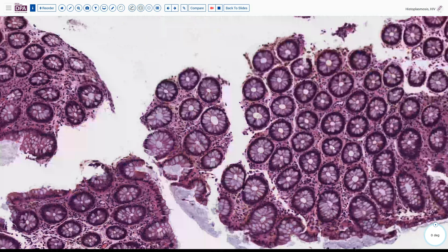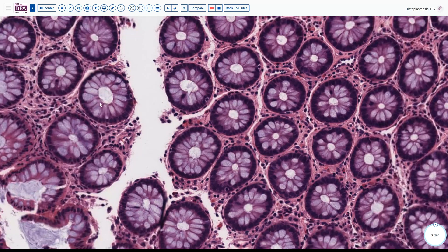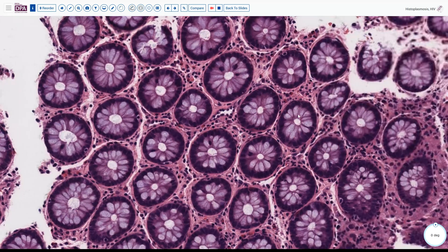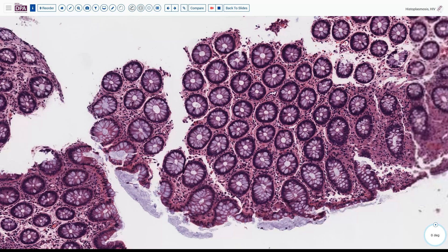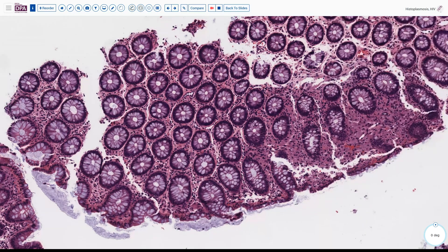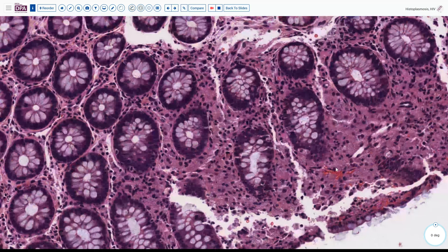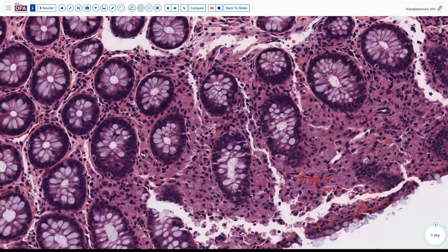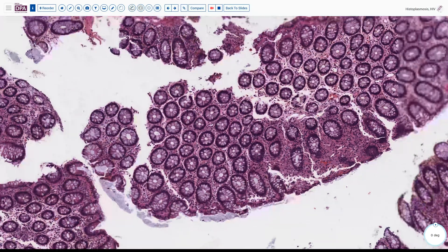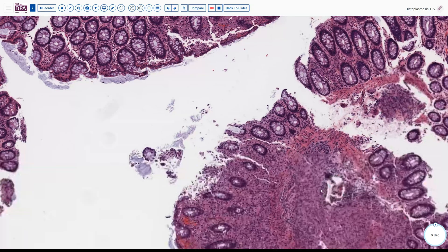Looking at the vasculature, we're not seeing evidence of CMV. The enlarged crypt cells are not present. But we do see these small areas where the stroma changes character — the glands separate slightly, the crypts are more separate. As we look in here, there's a little bit of busyness, maybe a little bit of bluish haze in these stromal cells. These do not look like normal stromal cells. This could be just histiocytes as in a xanthelasma-type lesion, but we see several of them.